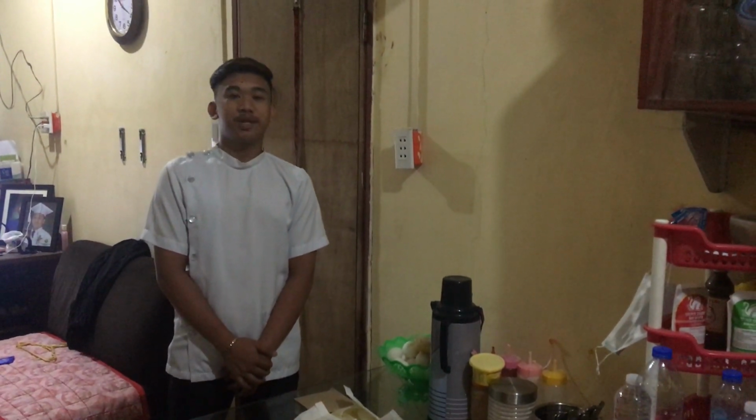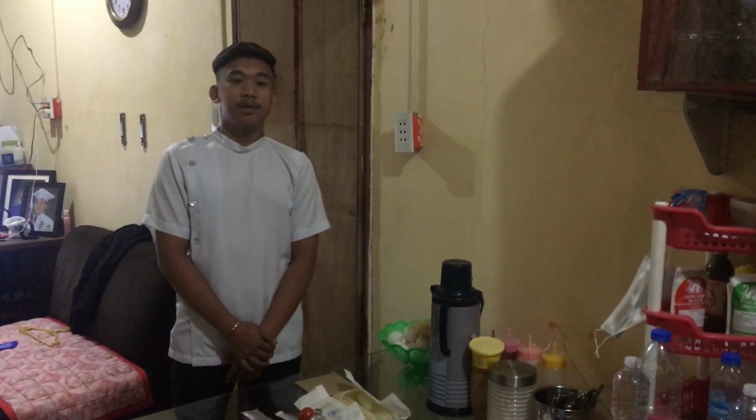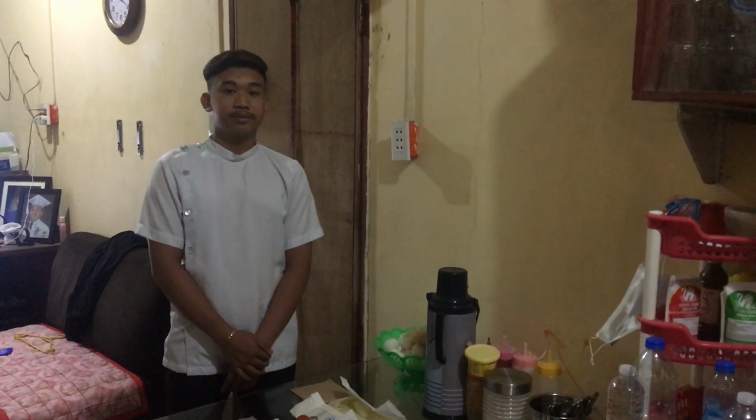Good day, I'm John Palacian, second year nursing student from Pamantasan ng Luzon de Marikina, and I'm going to perform preparing and giving medication through subcutaneous injection. Why is it necessary? Because it is one of the functions of the nurse to administer drugs to our patient.